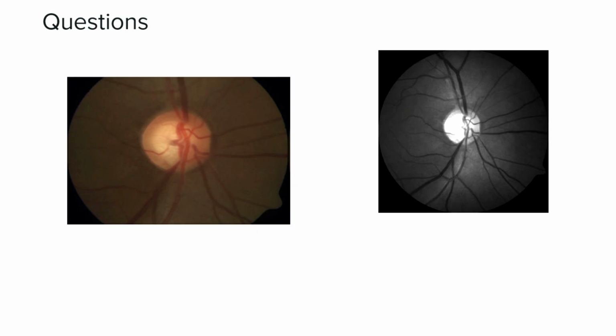Right side, you are seeing another picture, no? From there, you can also deduce something else. What picture is that? Red free filter. Can you make out the defect? Wedge shaped defect, inferior defect. Can someone point it out?